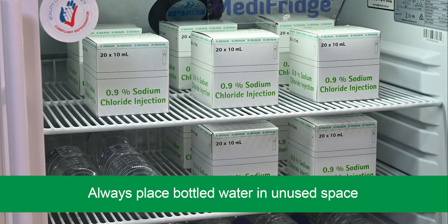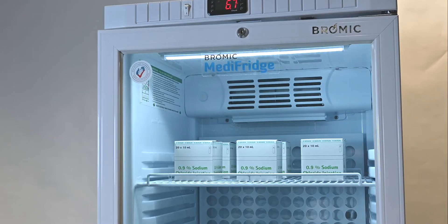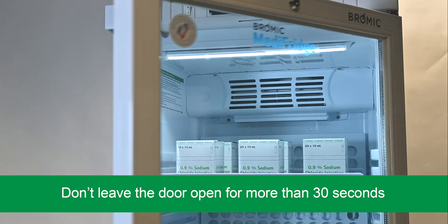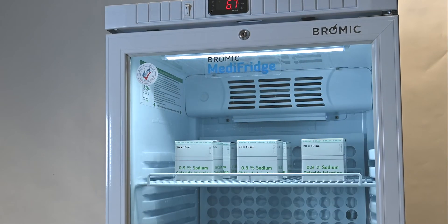Keep door openings to a minimum. When you open the door, ensure it stays open for no longer than 30 seconds at any time. Before opening the door again, allow at least one minute for the fridge temperature to stabilise.